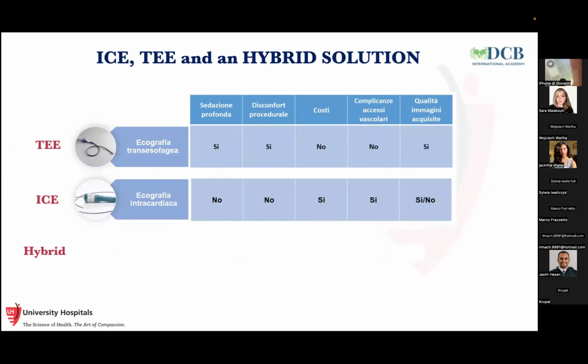What are the differences? Two main differences. With the TEE, we have more spatial resolution, so it's a quite safe procedure, mainly for a first operator or an experienced operator. With the ICE, where is the advantage? We don't need to sedate the patient, so the patient is completely awake and can be discharged, for example, on the same day.